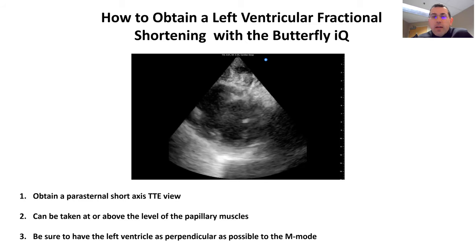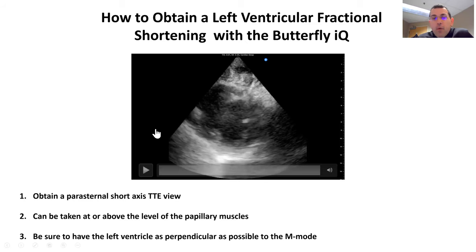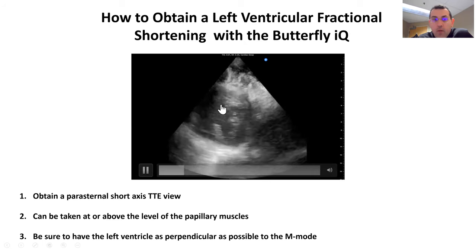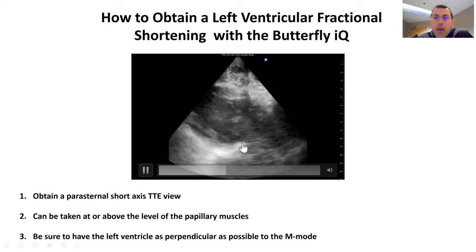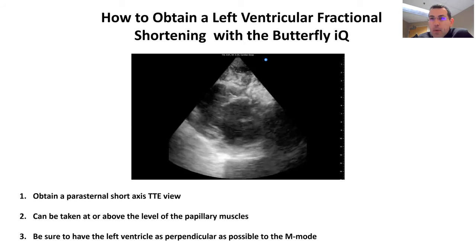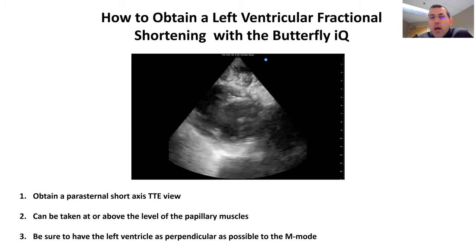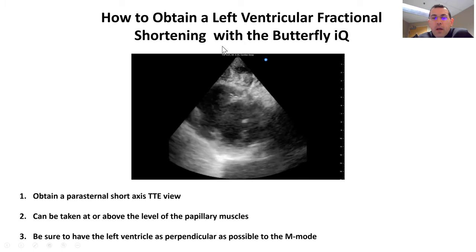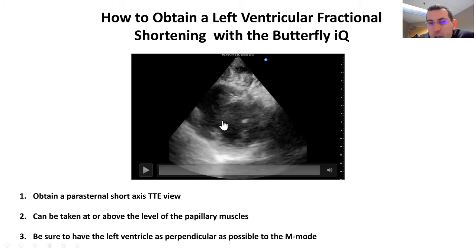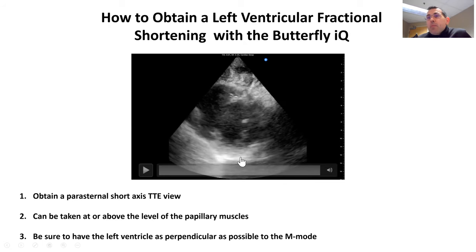They're in pain, there are bandages on, et cetera. But really, if you just get any reasonable parasternal short axis view, ideally maybe above the papillary muscles, and as long as you can get this donut right in the center of the screen so that when you put the M-mode on, it goes straight perpendicular through the left ventricle — that would be best.